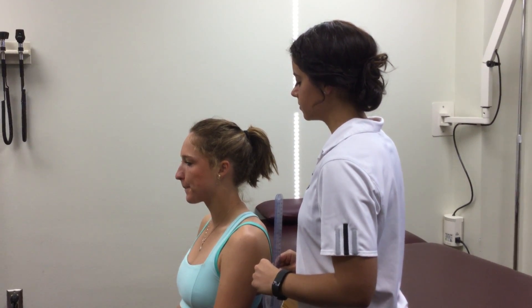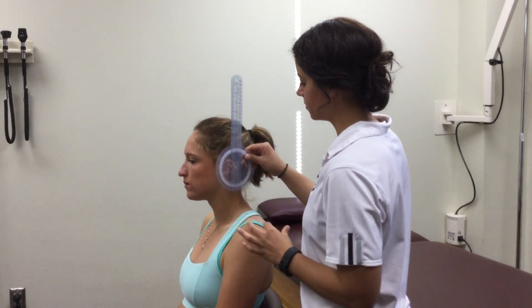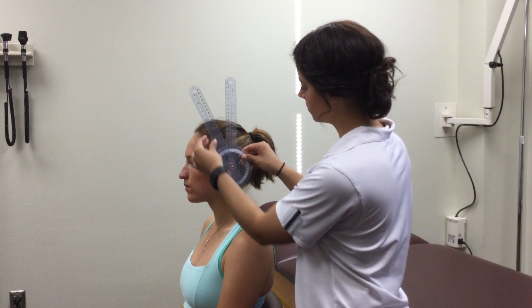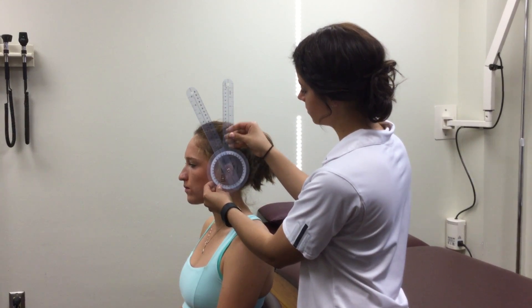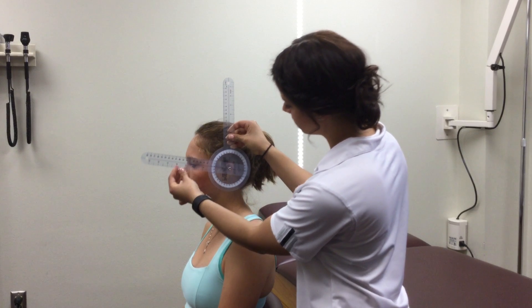Position the patient seated in a stable chair. Using a goniometer, place the fulcrum over the ear with the proximal end perpendicular to the ground, or straight up towards the ceiling, and the distal end towards the tip of the patient's nose.